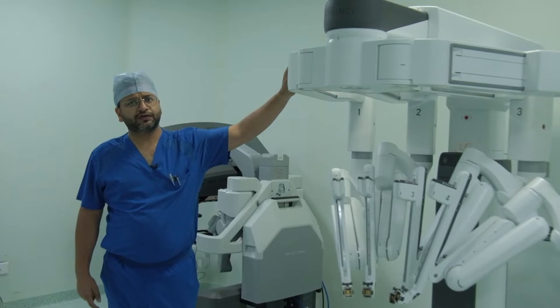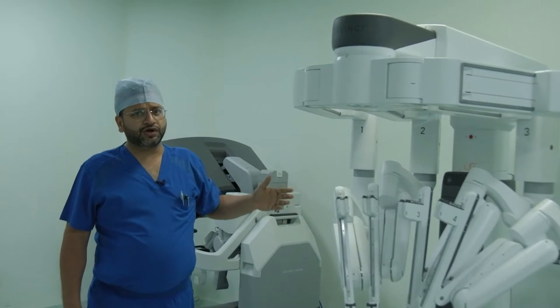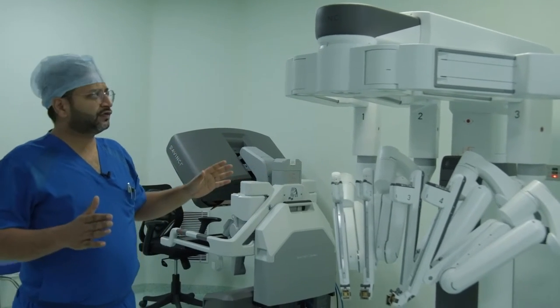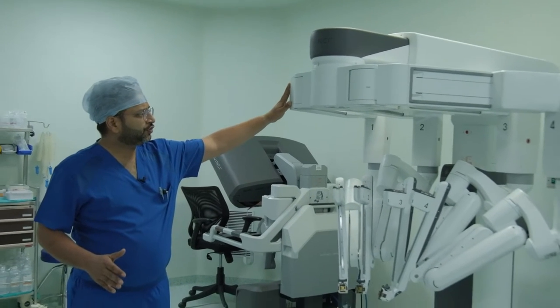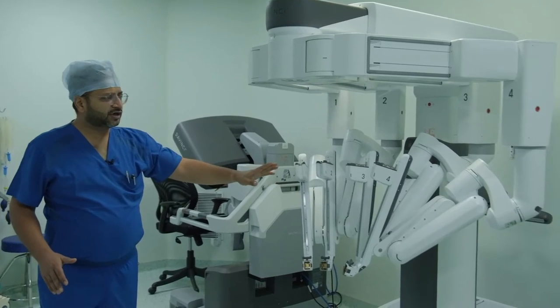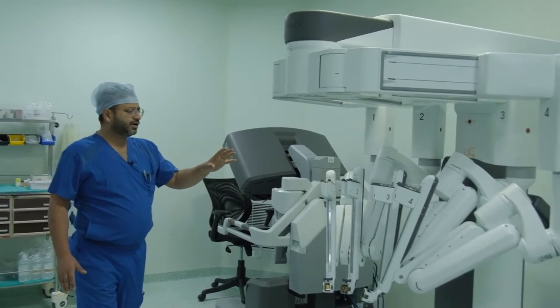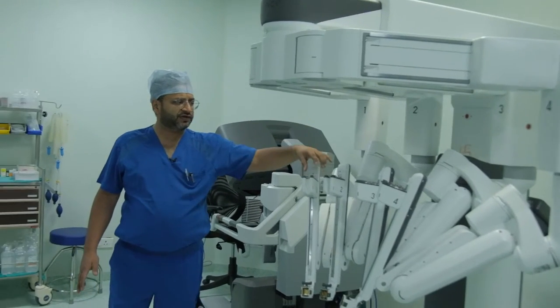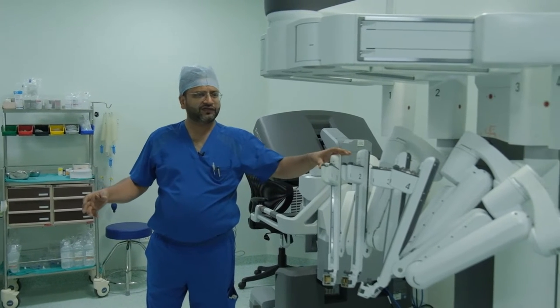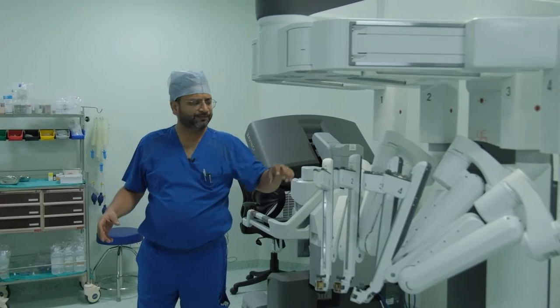So what is a robotic surgical system? Let us talk about it and we'll show you how it works. This robotic surgical system consists of three main parts. This portion here, what you see, is called the patient cart. It has the instrument arms and the switches to control it. The robotic instruments go in these patient arms, and they go inside the patient body, and this is the interface which is sterile and which is draped.